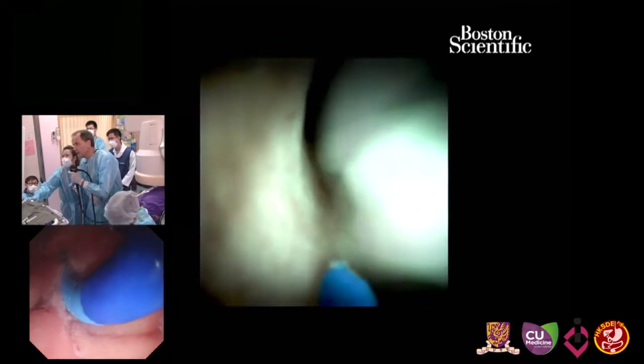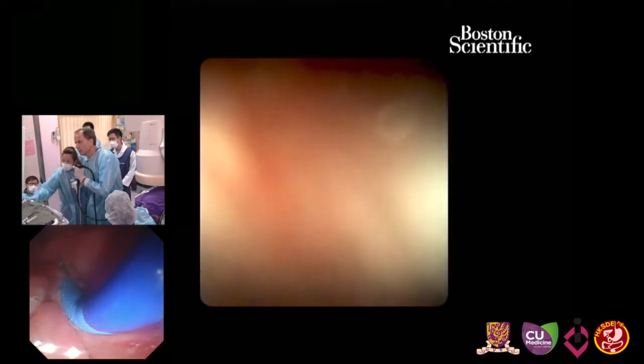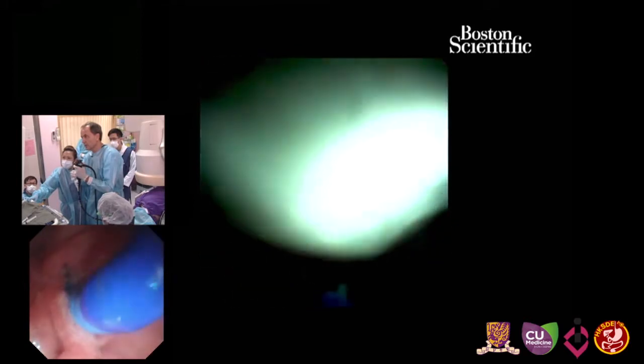Flush, flush. Yeah. But we are so close to the papilla. Okay, we see it again, the main duct, the fragmented parts, side branches here. I fragment again. But it's already broken, so we go alongside the stone. Here we see nicely the side branches, no damage of the duct.